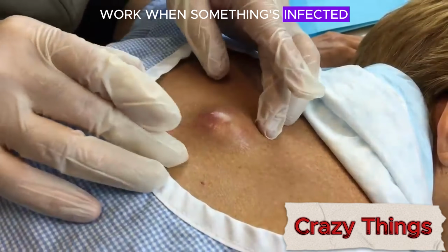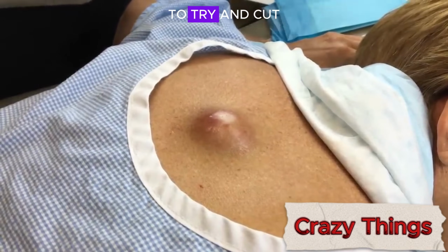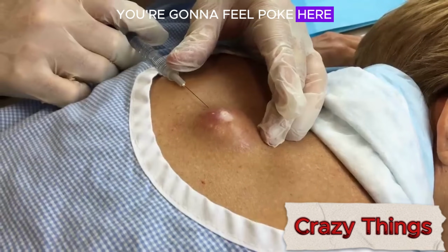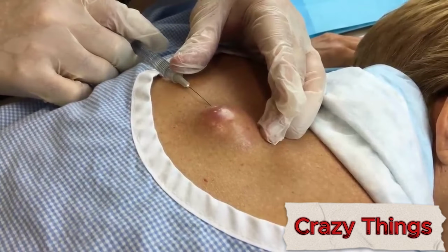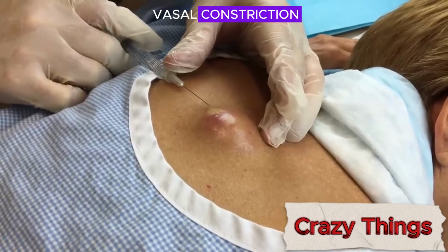Work when something's infected. So what we're going to do is we'll use something with epinephrine to try and cut off blood supply so there's less bleeding with it. You're going to feel a poke here and you'll see it blanch a little bit, and that's because the epinephrine is causing vasoconstriction.